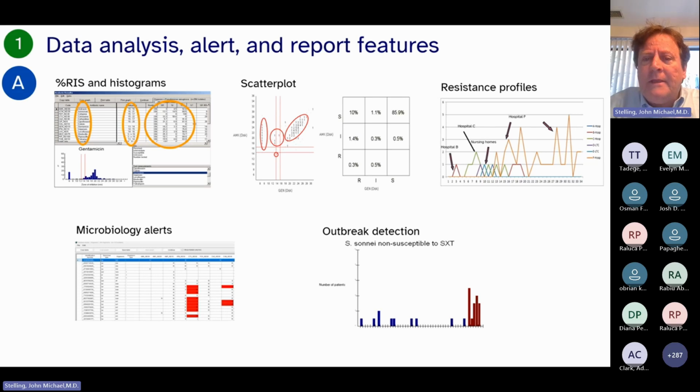That's an incorrect conclusion because amikacin is usually a more expensive drug and it's a reserve agent. We don't want to give these expensive reserve agents to every person because we will lose their value and efficacy over time. So an incorrect conclusion would be that gentamicin should not be used, we should use amikacin. A better conclusion is that for routine, non-life-threatening, simple community infections, gentamicin should be excellent.